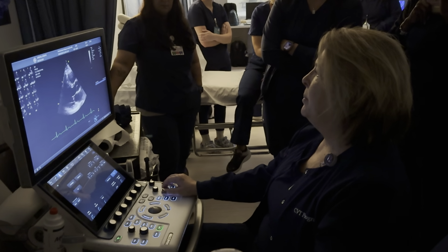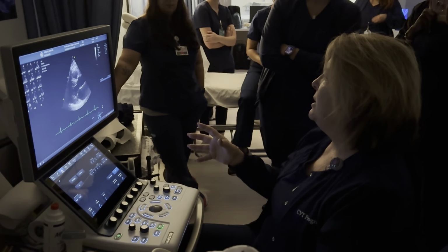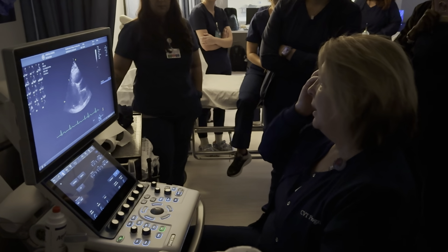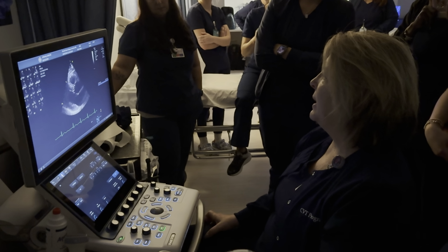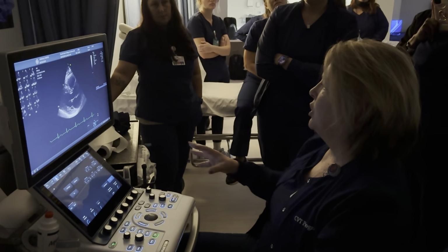When we're at the parasternal long axis, we're going to do 2D measurements, and we're also going to do color, okay? I'm going to talk to you about this. My vascular students already know how to do color, but I am going to talk to you about this.